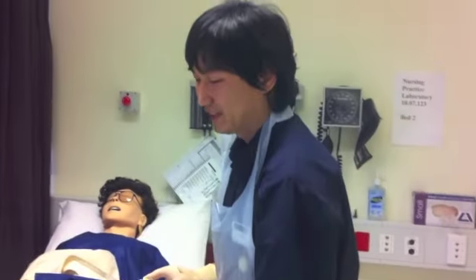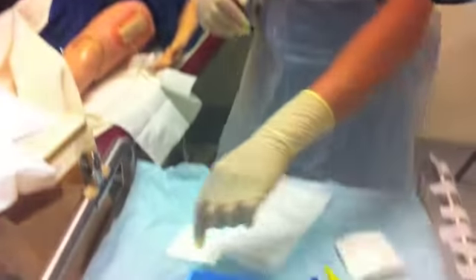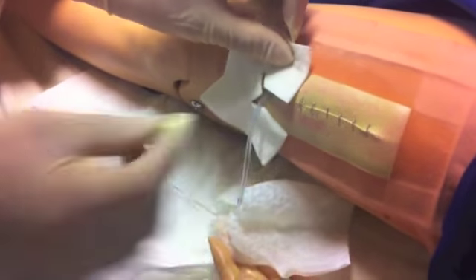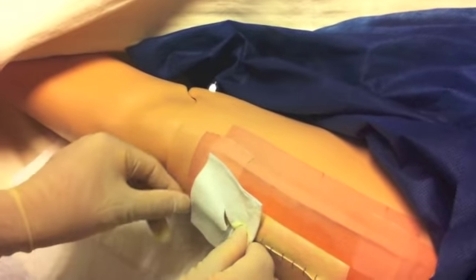Now that the drain site is clean, I will place the split dressing here, in position, and secure it with Micropore tape.